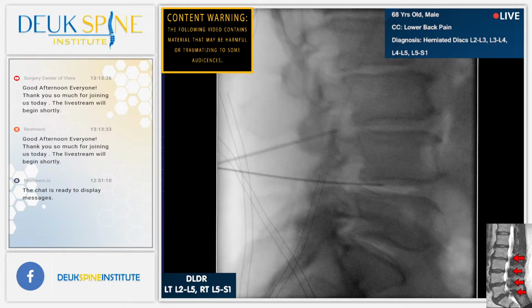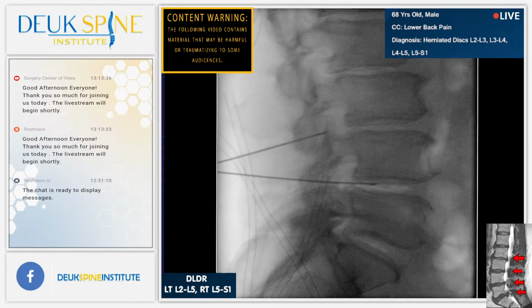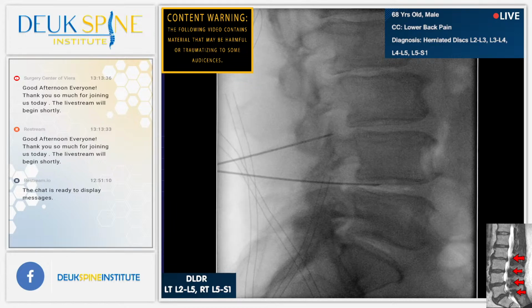That's beautiful. Let's get an AP view and look. I'm going to use the x-ray machine taking pictures of his spine to navigate. And what navigation means is to go from one location to another and to use information along the way. So if you think about the old captains of ships, right? A long time ago, hundreds of years ago, they used the stars to navigate. They also used mountains and islands to navigate. So they used physical structures to guide their voyage. And they were looking for the most direct path. They were also looking to avoid crashing their ship and dying out at sea.